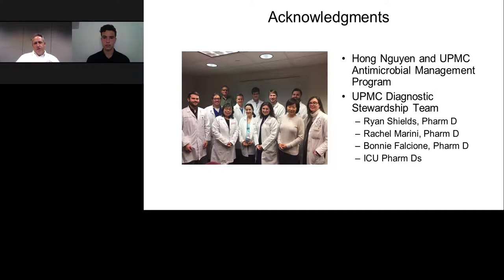I think in Candida infections, the impact in time is going to be even greater. Not uncommonly for something like Candida parapsilosis, for example, you might be 5 days or more before a blood culture turns positive. So getting the result within 5 hours versus waiting 2 to 3 days, or in some cases 5 or more days for Candida identification, I think has potentially very important impact. And again, for both these things, hours can make a difference. So for both Candida and bacteria, any window that you close potentially has real impact.